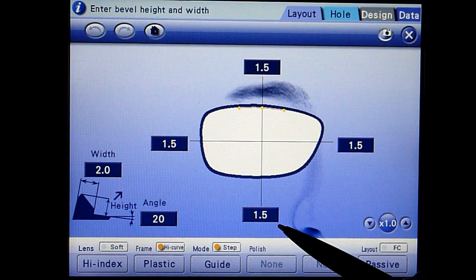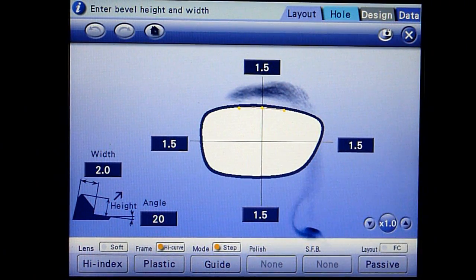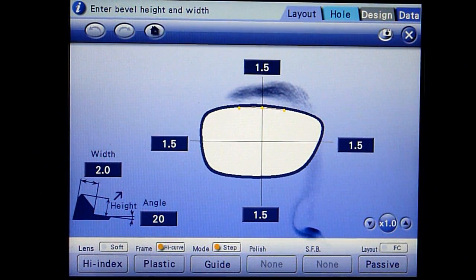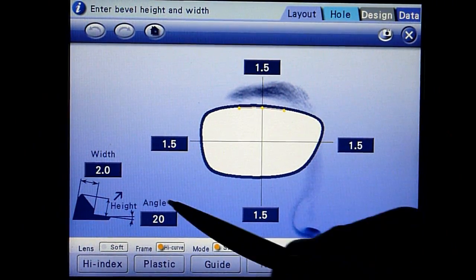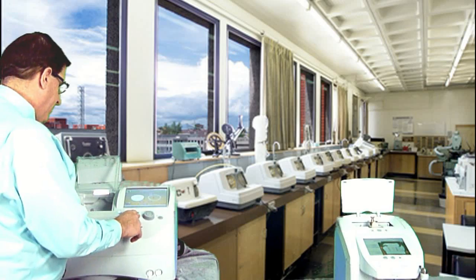The step height of each quadrant can be adjusted independently. Adjust the width to match the thickness of the sample that came with the frame. Start the edging process.